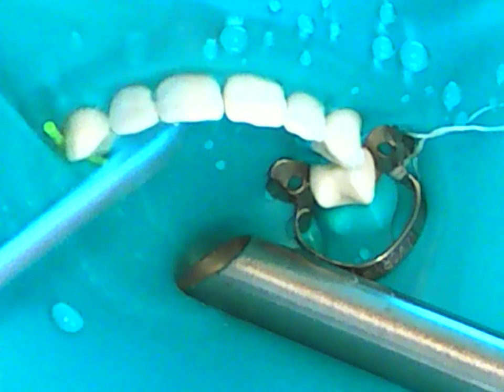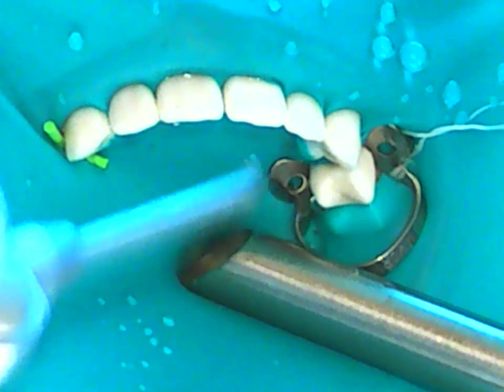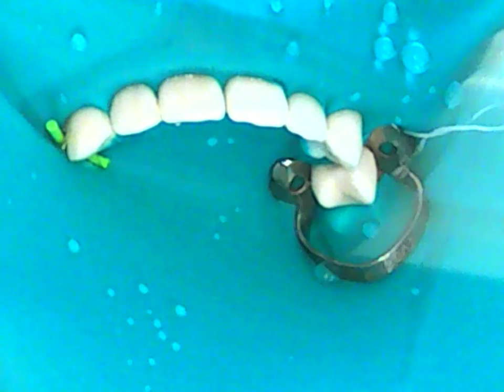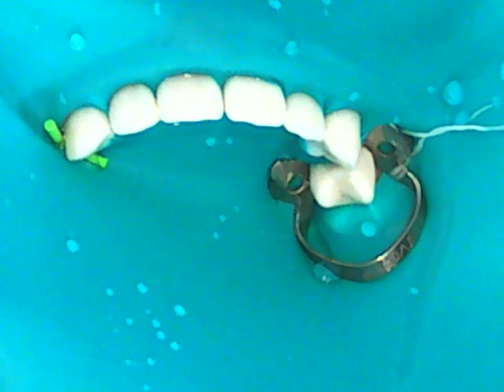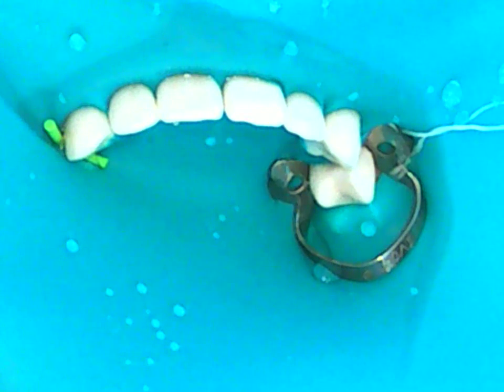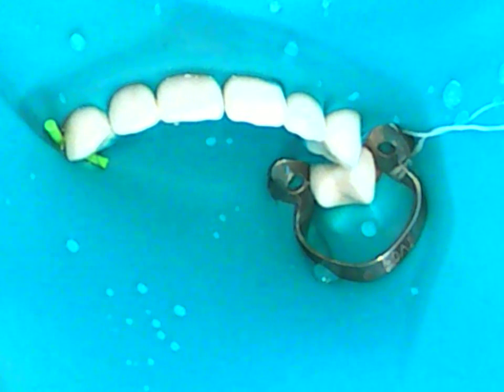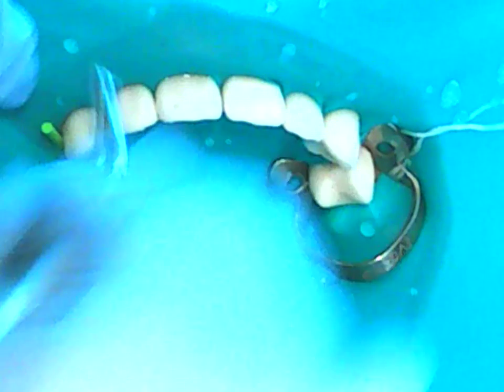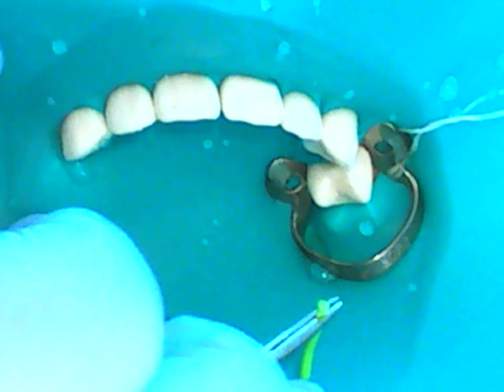Okay, allow the water to go into that trough while you rinse. So it's just a simple facial, lingual. You may want to clean up the dental dam a little bit. It doesn't have to be an extension, a long rinse, just a quick rinse is most likely what you will need. You are ready to remove the dental dam now. Okay, so you will remove your ligature first. Okay, so the stabilizing cord that you used, you may use your, I'm fulcruming and removing it.